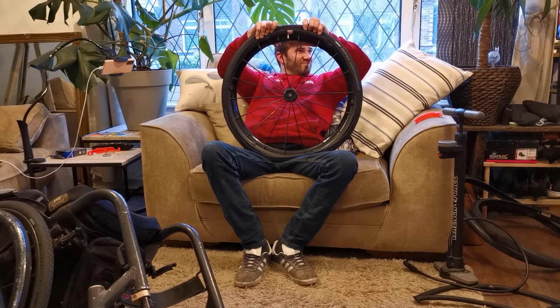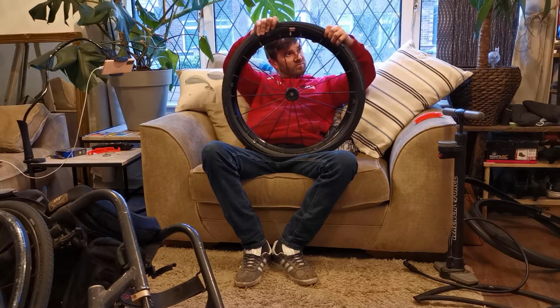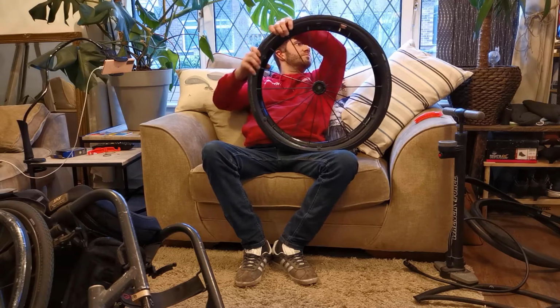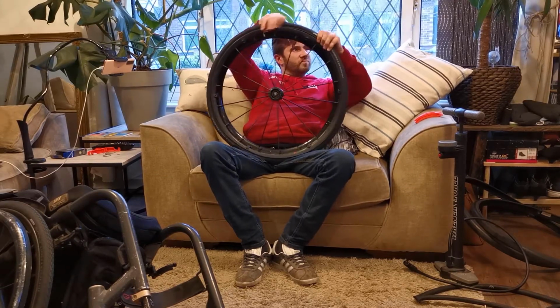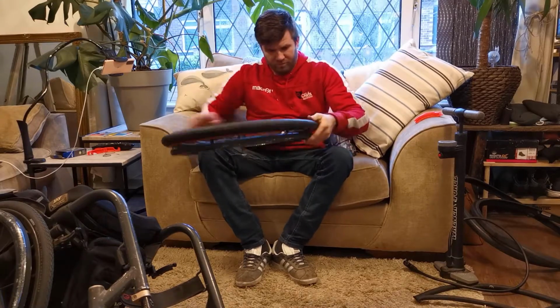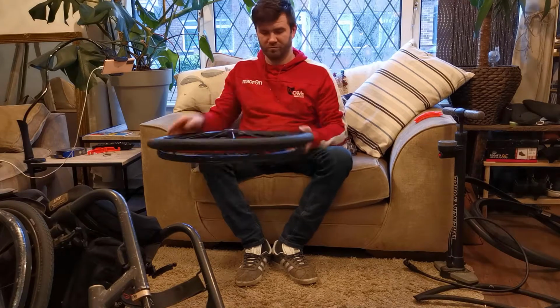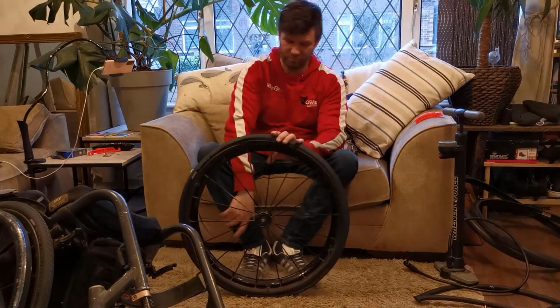And then what I'm going to do is use my hands to fight and get that bead back into the rim. Now this can be quite difficult. The bead on a Marathon Plus tyre is incredibly strong, so it can be a little bit fiddly and can take some practice to get this right. Once you have got it in, you can just press down on either side and work your way around to the top.